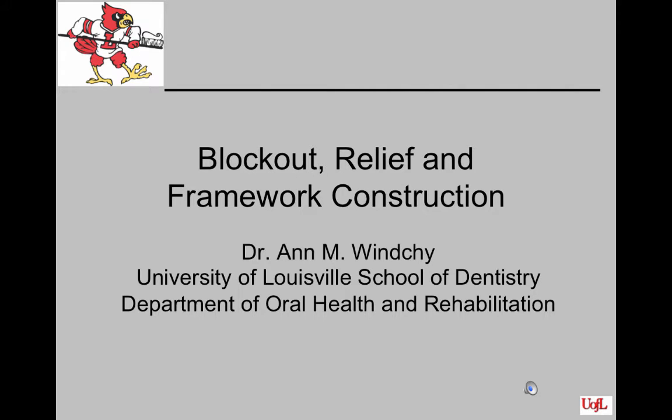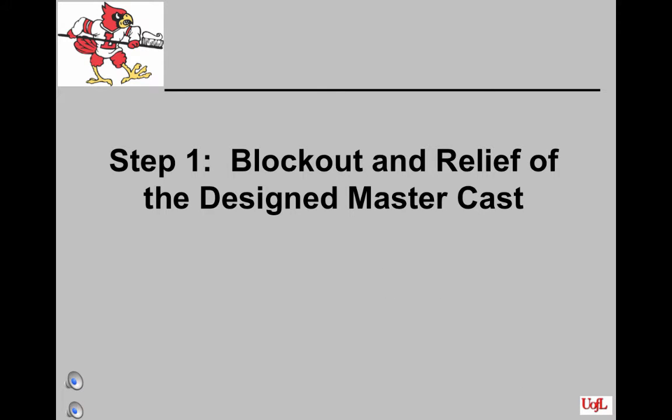This lecture will show you how a removable partial denture is constructed when you send the master cast with the design on it to the laboratory. The first step is to apply blockout and relief to the designed master cast. We'll talk about this more as we go through the lecture. The laboratory may choose not to use the dentist designed master cast, in which case they make a duplicate on which to do the following steps.